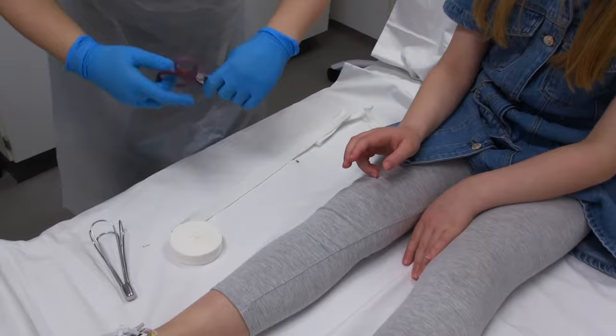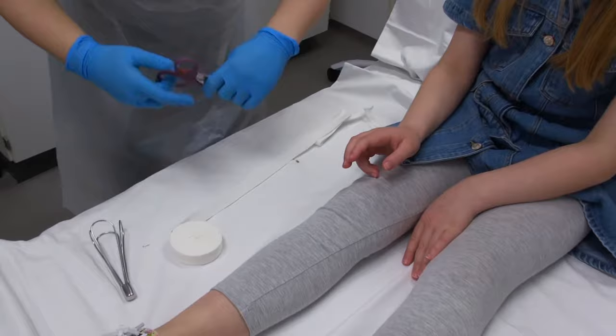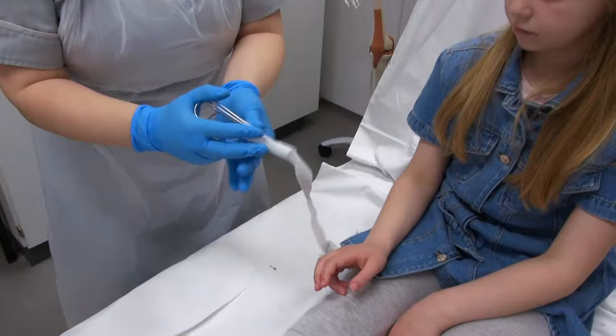Just need a good length. And just slip off what we don't need. And then just feed it through.